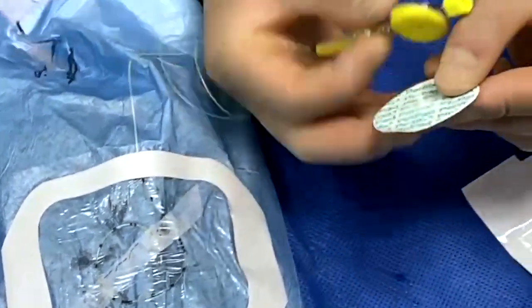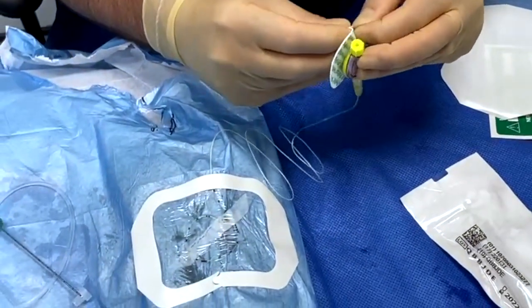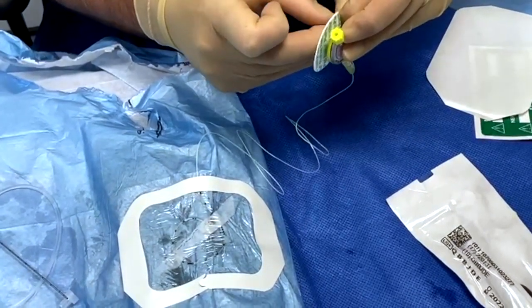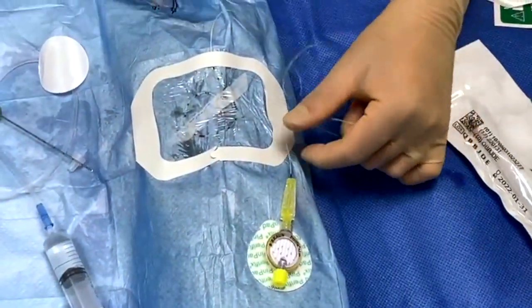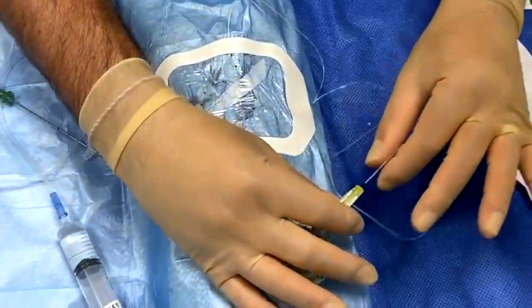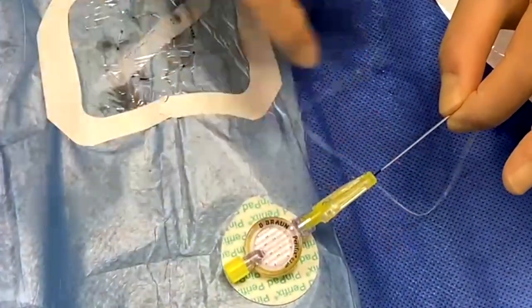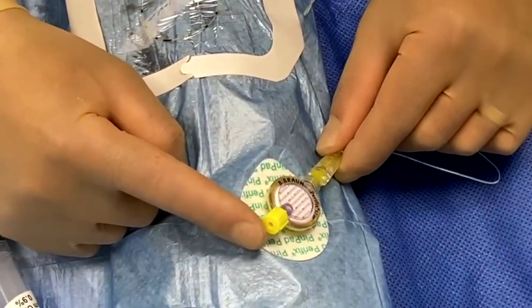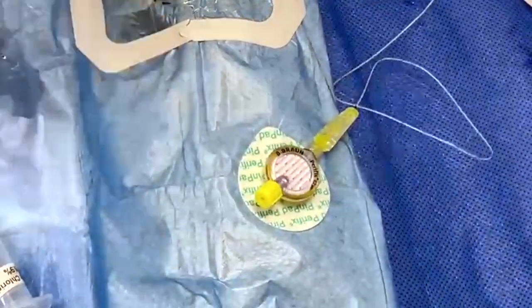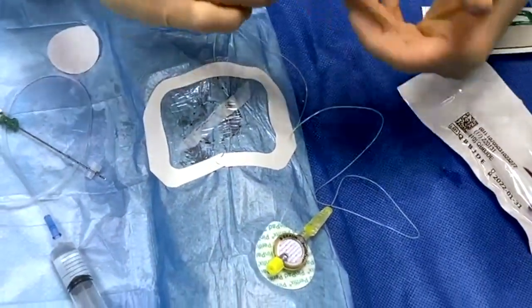The last stage is to ensure the catheter is secured safely. You can place a filter on it, remove the adhesive part on the back of this ECG-dot type structure, and secure that at a point further up on the leg. There is another weakness point between the catheter and the clip where it could come disconnected — you can place tegaderm around that or put a little glue around the exit site. This tip connects to the local anaesthetic infusion line, and you can secure all of that in place. Within the set there are nerve block stickers which it makes sense to utilise — place one along here.